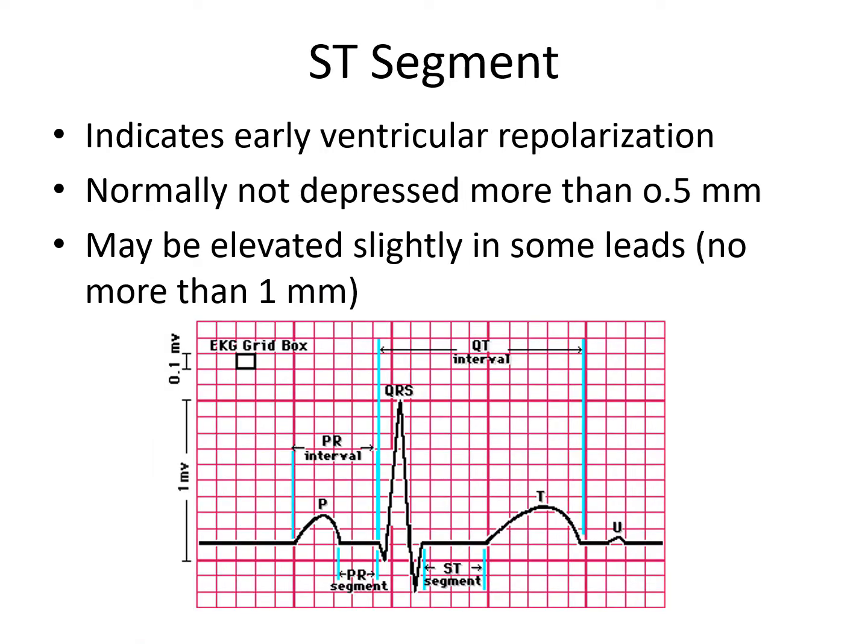Let's say a word about the ST segment. The ST segment represents early ventricular repolarization. As we said earlier, it's normally not depressed more than about 0.5 millimeters, and it's normally not elevated more than 1 millimeter.